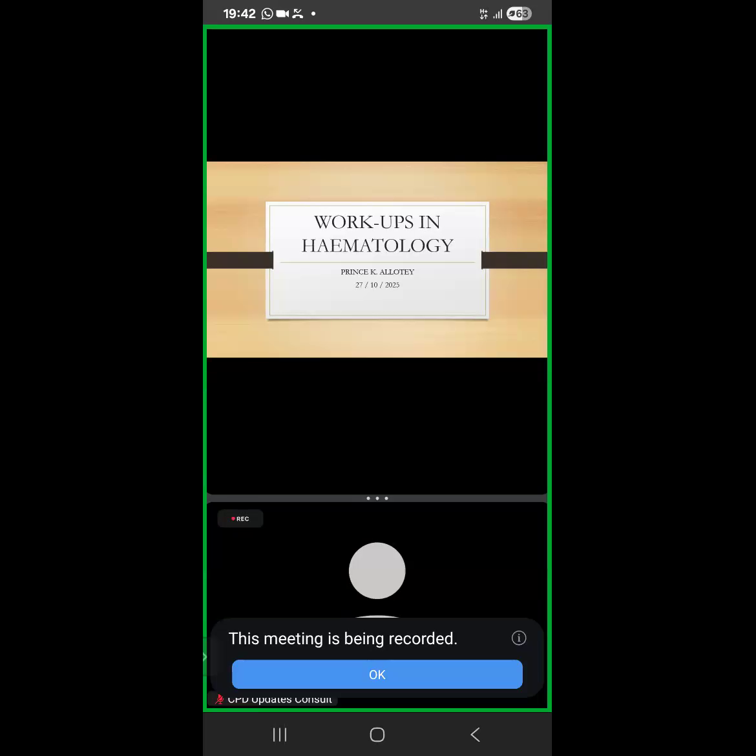And we also learned that in hematology, the first thing, or what we call the screening test, will be our full blood count, followed by evaluation of a film. And so we want to talk about simple workups that involve a story that is told, or if you like, a clinical summary that is told.